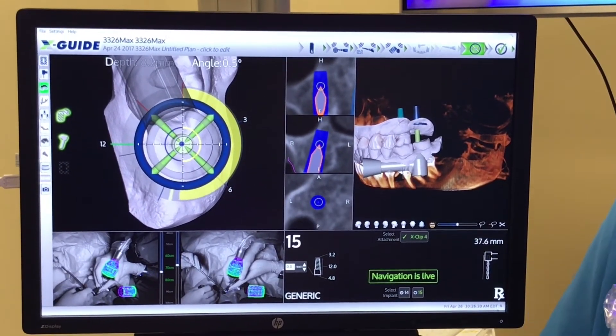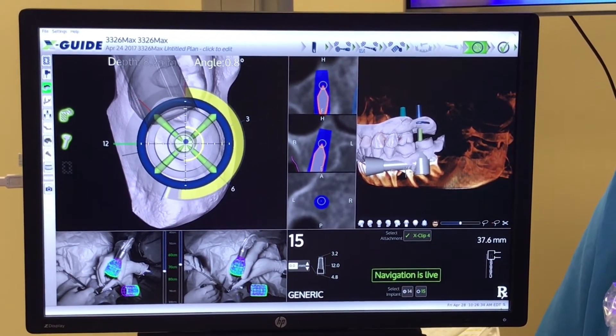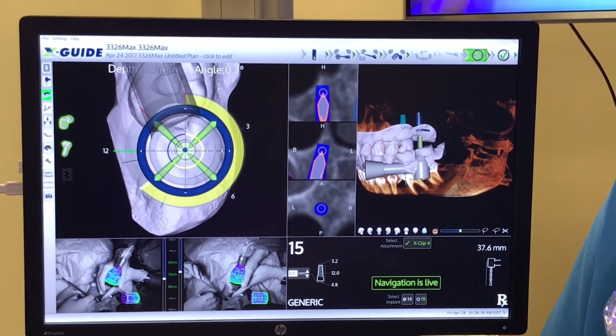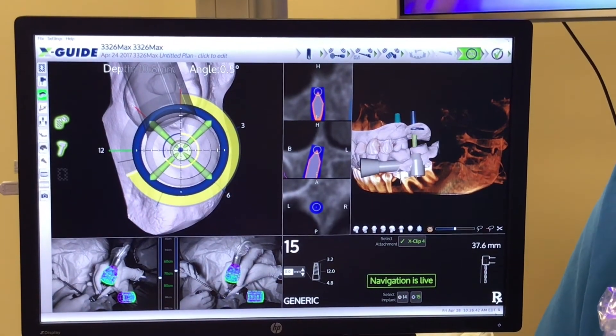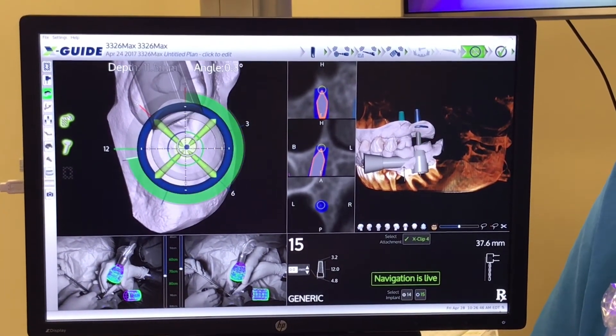As we drill down, the color indicates depth. When we reach the maximum depth and go beyond it, it goes from green — which is the ideal depth — and then it will turn red when we go past the ideal depth, indicating we've gone a little too far.